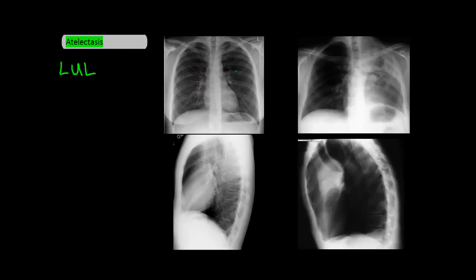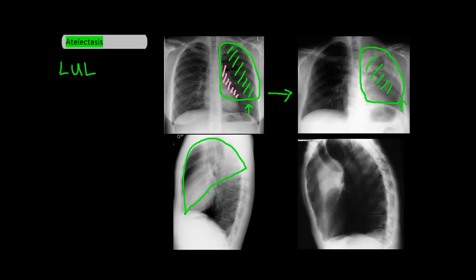Next we have the left upper lobe. On the PA, the normal left upper lobe dimension is here. With left upper lobe atelectasis, it's a little different than what we've seen before, because instead of a clearly visible shift in a fissure, we'll see a general area of increased opacity where the left upper lobe should be. You can also see silhouetting of the left heart border and mediastinum, and if you look closely, the left diaphragm is also elevated to fill in for the loss of volume in the left chest. On the lateral, the normal left upper lobe is here, and with atelectasis, the major fissure shifts inwards to make up for the volume loss.